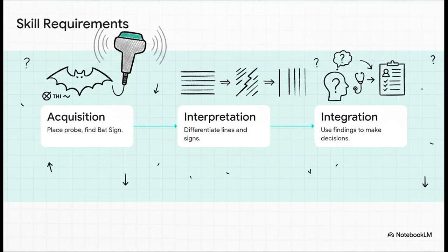We can really summarize the entire philosophy of this explainer using the rule of threes. To truly master this, you need three distinct skills. 1. Image acquisition, actually placing the probe, making sure the probe is oriented correctly, and finding your bearings. 2. Image interpretation, knowing a seashore from a barcode, an A-line from a B-line. And 3. Image integration into care paths, taking that static you just interpreted and making an immediate real-world clinical decision. Snapping the picture is really only step 1.